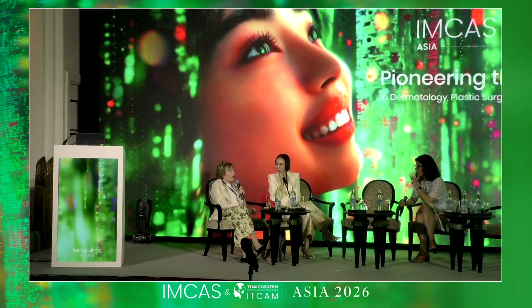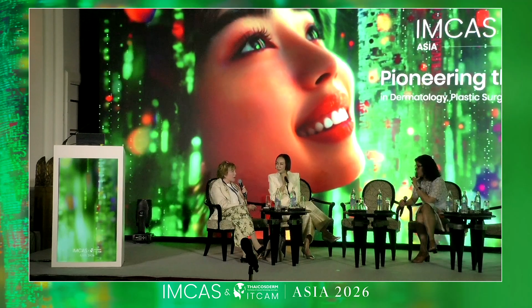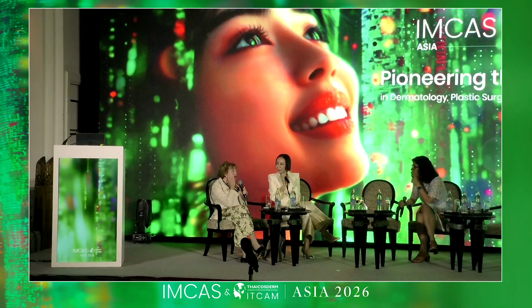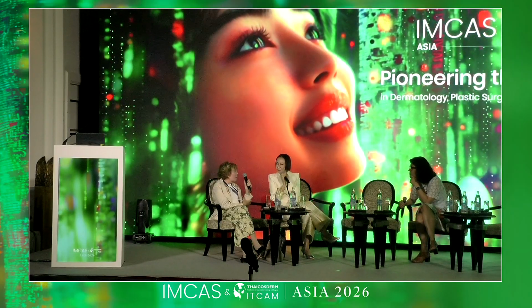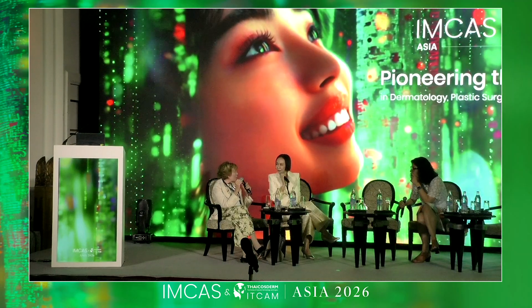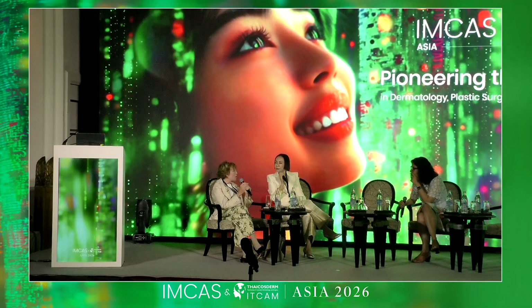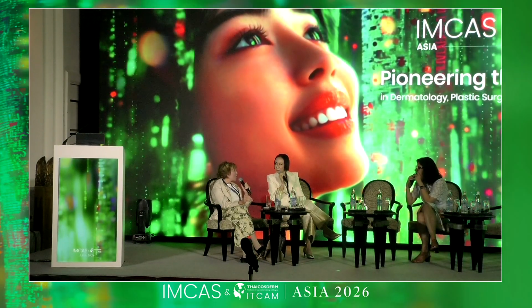I'm sure you have. Because most of what we do is surgical, energy-based, biological, there are some ways that you can further enhance uptake. I have a radiofrequency device that you can apply either using a monopolar disc, or the thing that I have, which is really pretty novel: you put the provider pads on your lower arm or the base of your upper arm, and then have one of your staff give the patient a facial massage. The radiofrequency energy actually comes out of the provider's fingertips, and it's just a lovely experience. The warmth will increase the uptake and decrease the stinging on application. I don't know if the outcome is any better, but the application experience is.